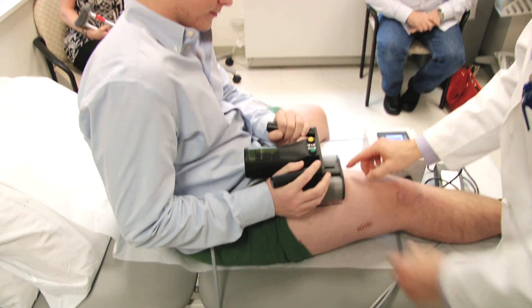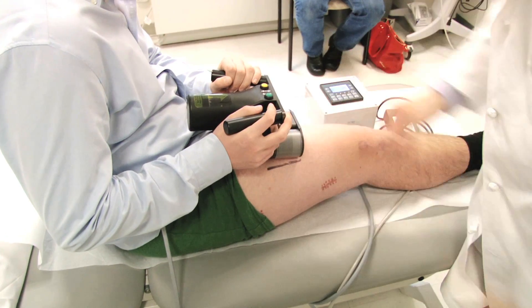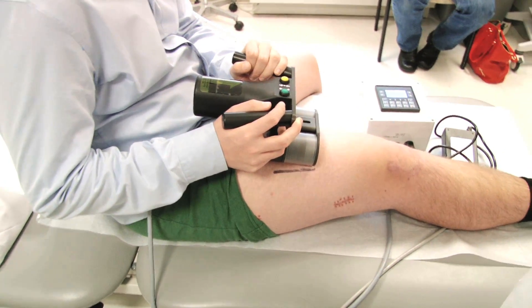We're going to do it through some small incisions. I'm going to cut the bone, stabilize it with a rod, and teach you how to elongate the leg by doing this treatment. You're going to be on crutches for three months. I told him the elongation will take about six weeks, and that the additional healing will take another six weeks. By then I'd most likely be able to get you off crutches. And today is just about three months since the initial surgery — and in fact, it has gone exactly like it was supposed to go.